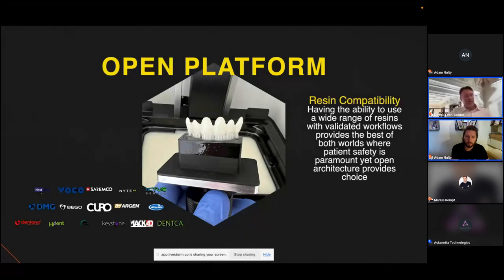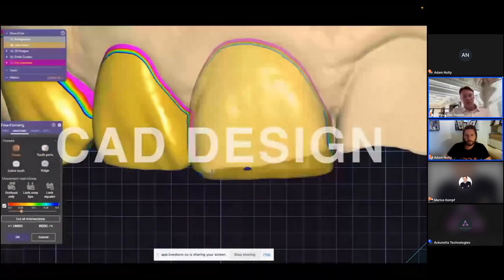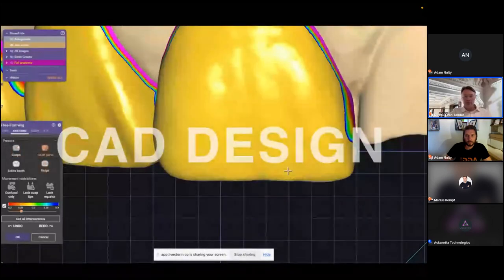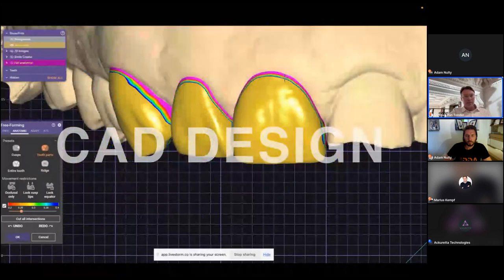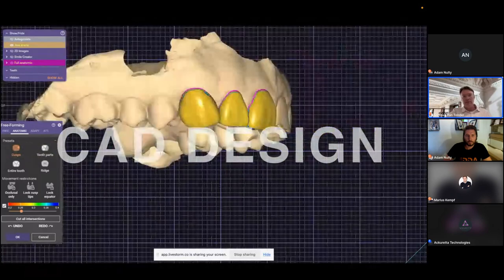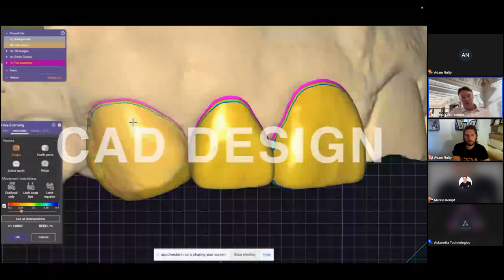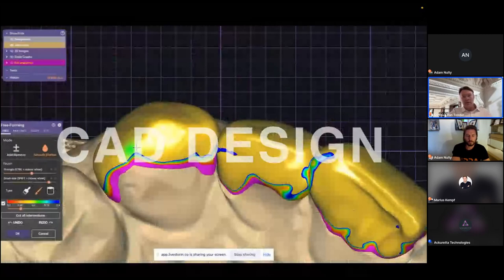So when we get to CAD design, depending on what we are doing, but for most of our CAD designs, especially smile designs and things like that, we use something that can export an STL for you. Our favorite software for doing this is ExoCAD, and a close second would be InLab. But the beauty of ExoCAD is that you can mock up multiple teeth very quickly, very easily, and send that to the printer to either print a model or print a mock-up for you directly, depending on your designs. So CAD design is a big part of your software arsenal that you need in your practice. It's becoming an indispensable part of practice.